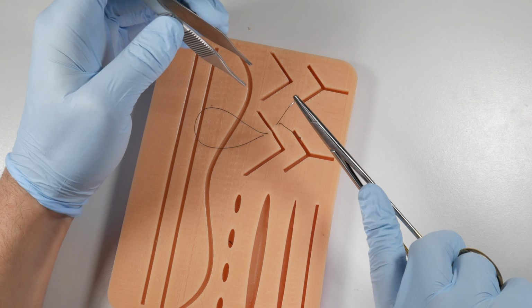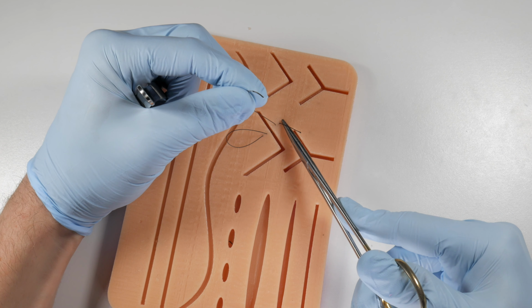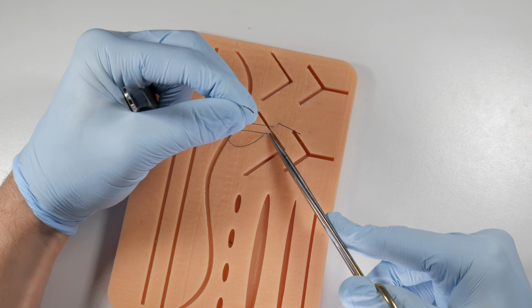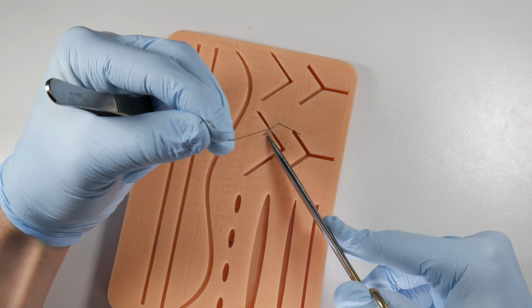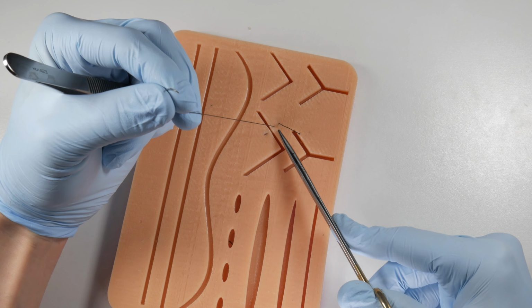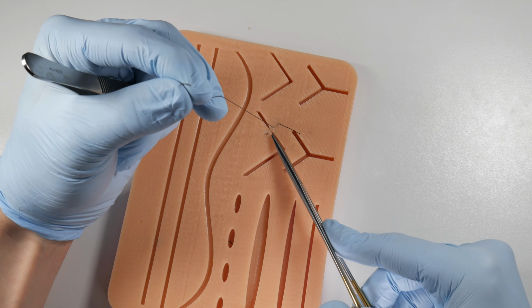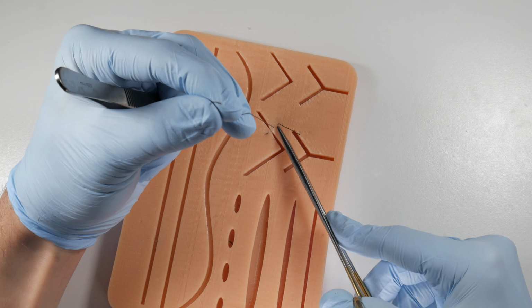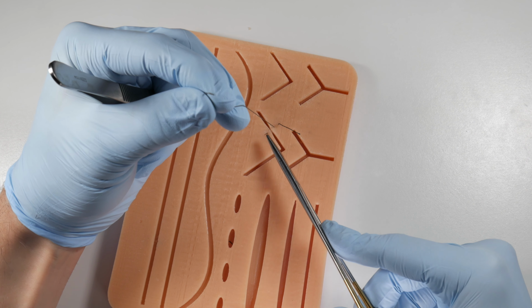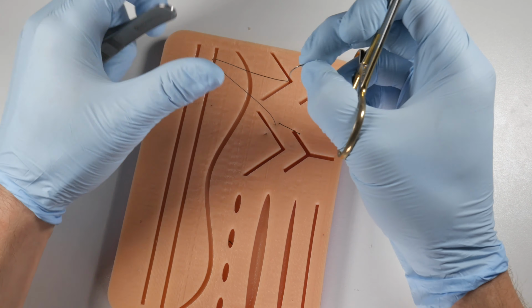Now, what we've done here, and you can see very clearly, is we've created 4 different points here. So 2 entry points that are farther, and 2 that are closer. And as we pull this together, what we see is basically not much crossing there. Everything is kind of under the tissue, but we're pulling this together. So if I apply some tension here, you can see what's happening. This is starting to close up the tissue, and we've got 2 strands of the suture passing here underneath the tissue to hold that tightly together to resist the pull from the muscles.